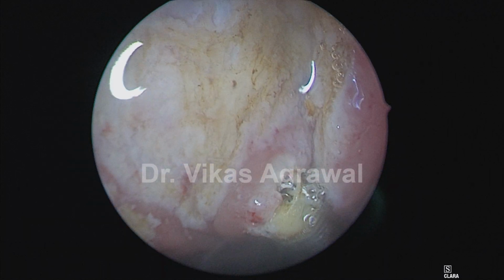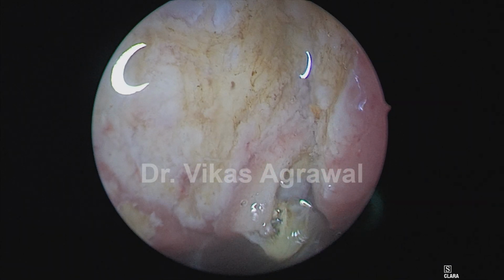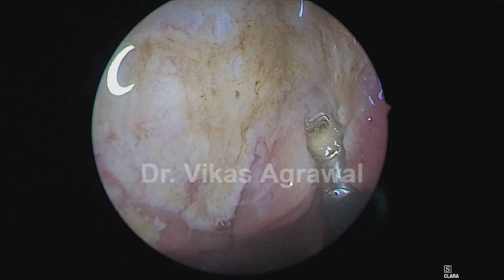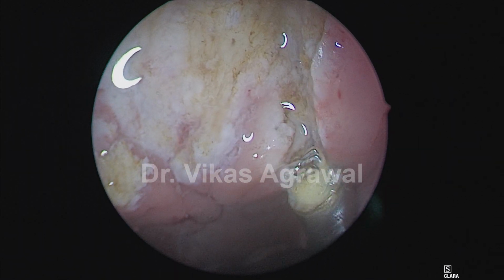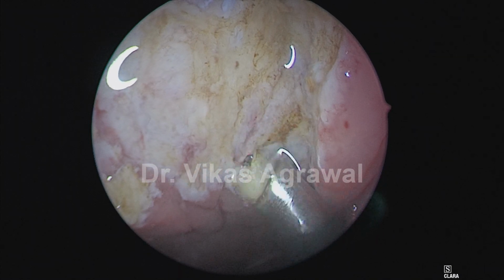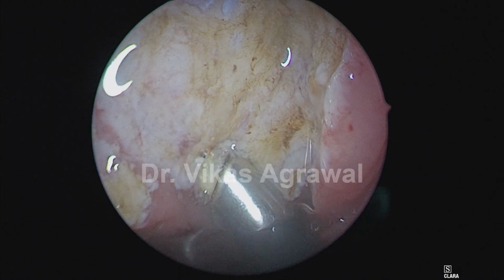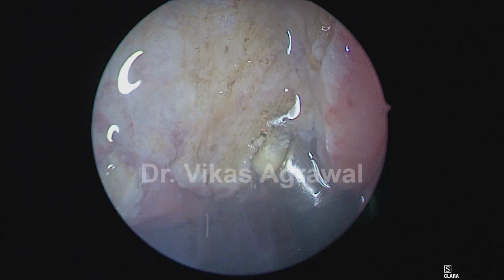So whatever lymphoid tissue is there will be completely cleared from behind the torus tuberis, and that's the lower or the inferior boundary, which is the passavant ridge. This area is the area of the passavant ridge.